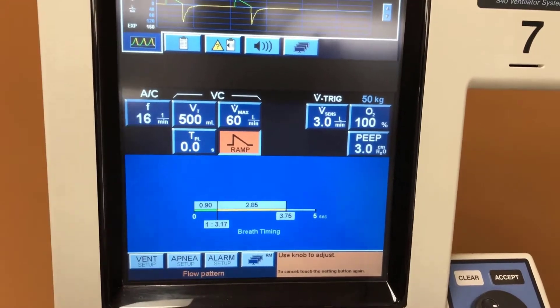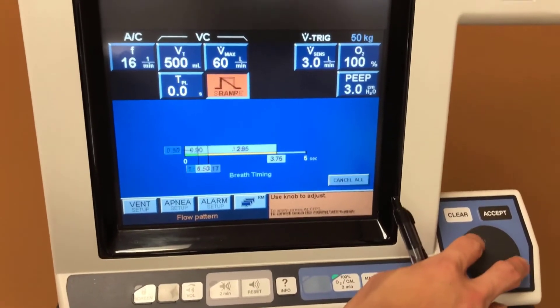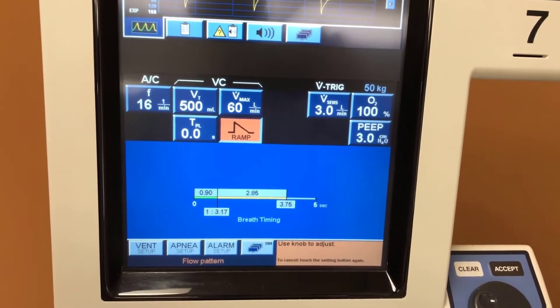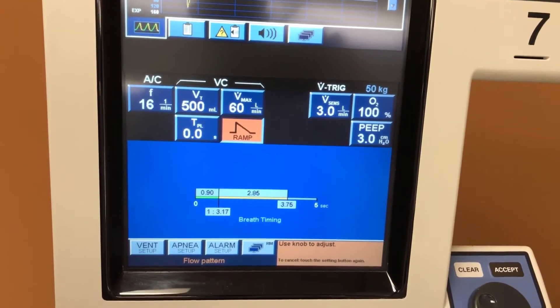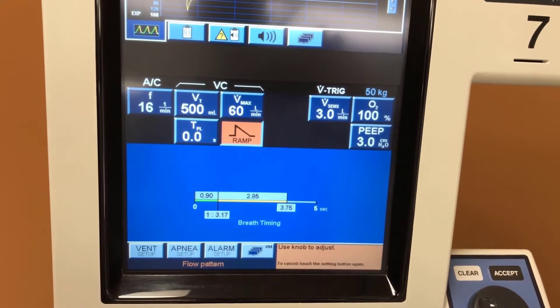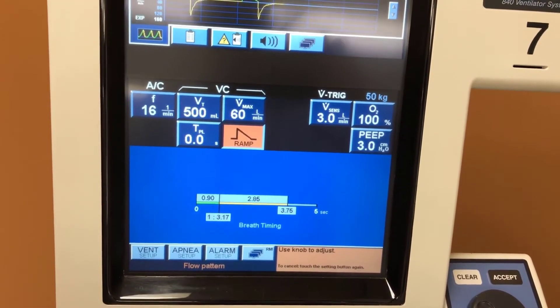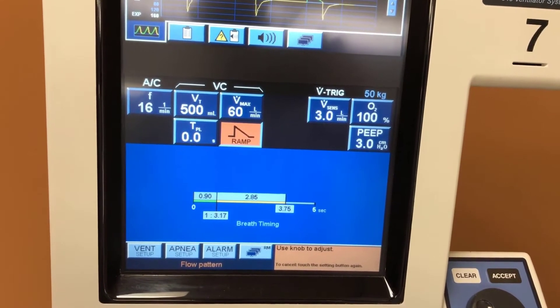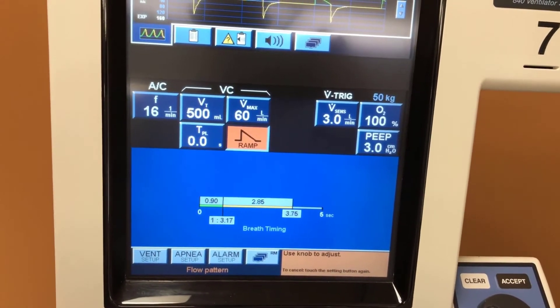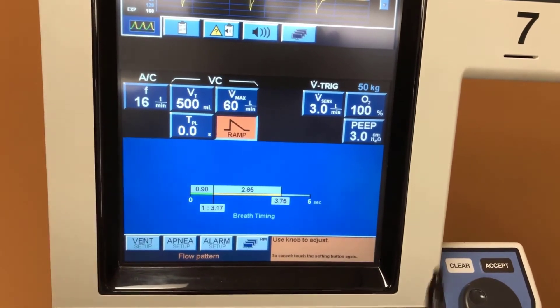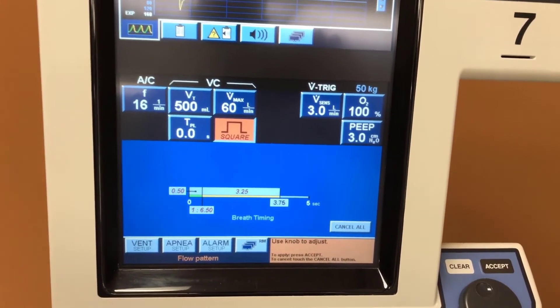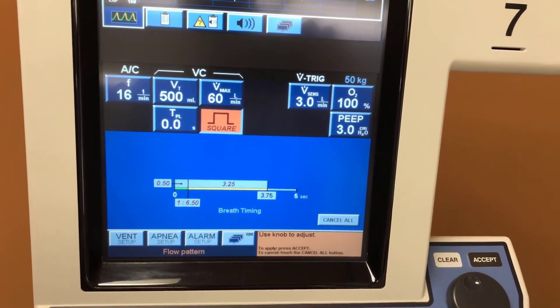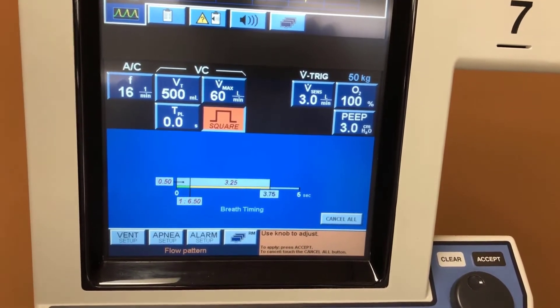Down here we can set it to either ramp or square — this will be the pattern of the waveform. In the ramp setting, it will initially deliver a rapid flow of air and then that flow will slowly descend until the end of inspiration. For a square waveform, it will deliver air and keep that flow at the same rate until the end of inspiration.